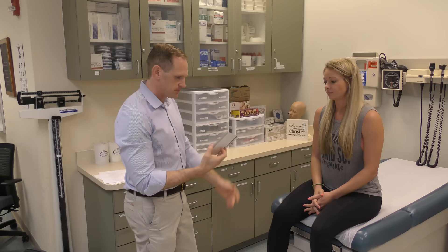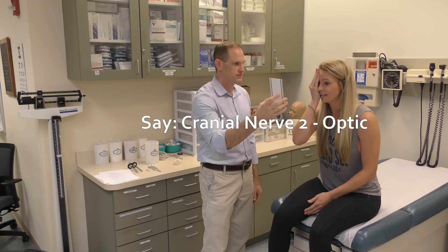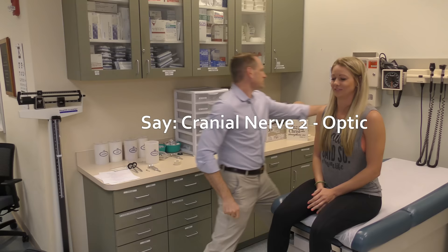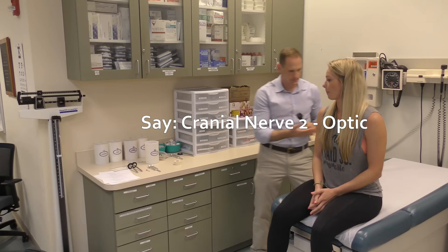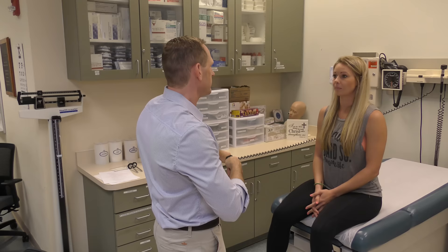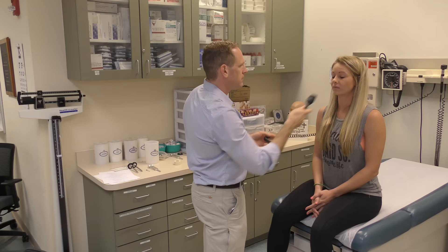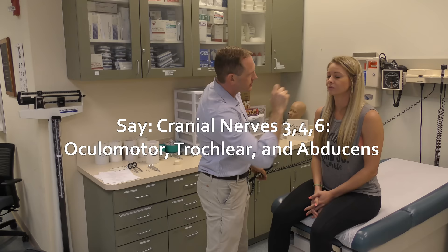Read the smallest line you can read. Four, two, eight, seven, three, nine. Okay, and the other eye — four, two, eight, seven, three, nine. You just memorized that. All right, look straight at me — corneal light reflex, looking for where the light reflects in both eyes. Inspecting the eyes; pupils are equal and round and they react to light, consensual and direct. Look across the room, focus, and focus on my finger — accommodation.